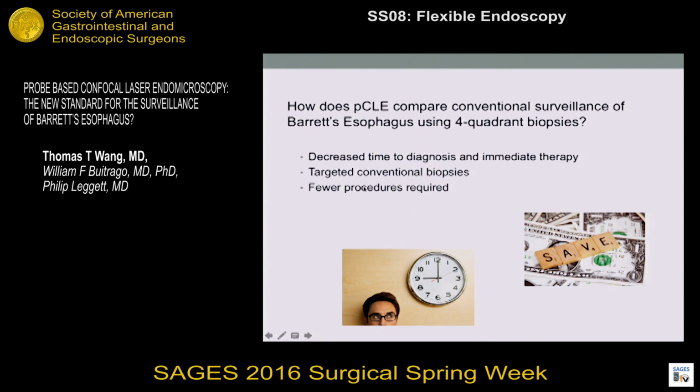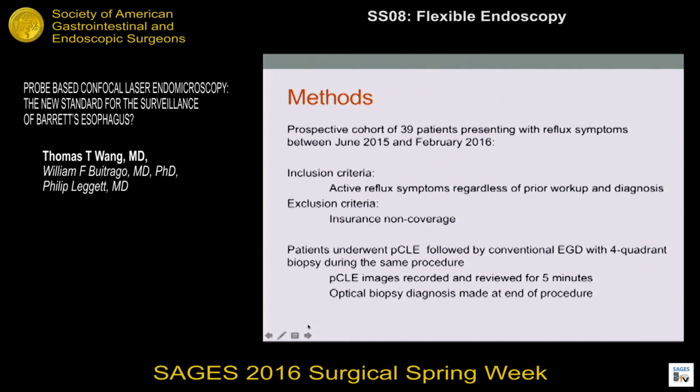Among other advantages are decreased time to diagnosis because you're obtaining an optical biopsy at the bedside. There's a potential for targeting biopsies, using what you see at the bedside to direct your biopsies rather than random sampling. And there's also potential for fewer required procedures.